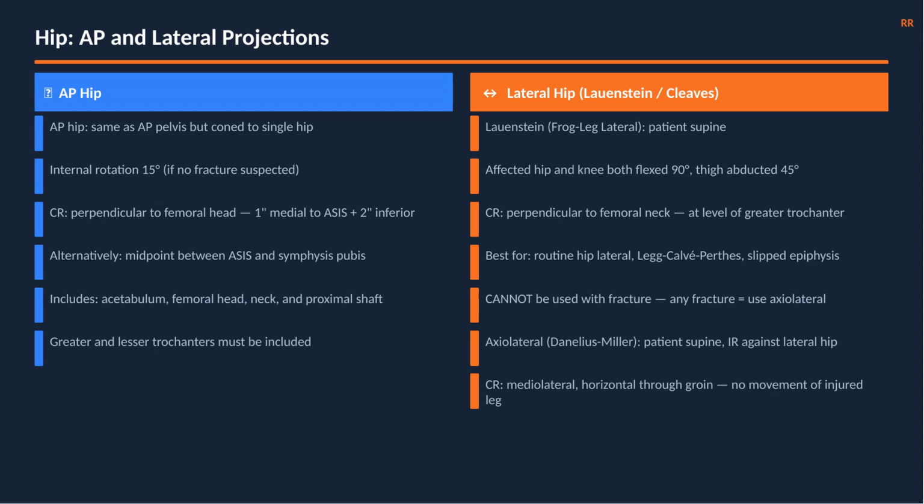Best for Legg-Calvé-Perthes disease, slipped capital femoral epiphysis, and routine hip evaluation. Cannot be used if fracture is present or even suspected. Flexing and abducting a fractured hip is dangerous.